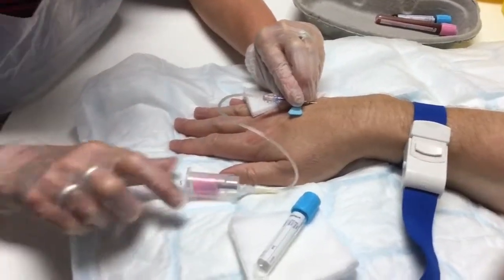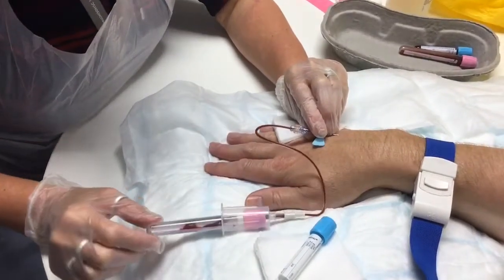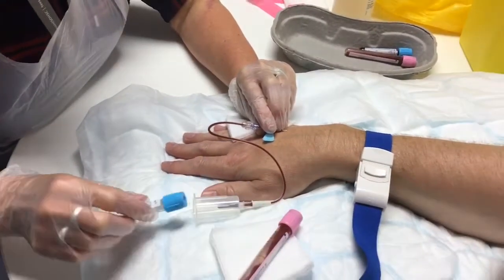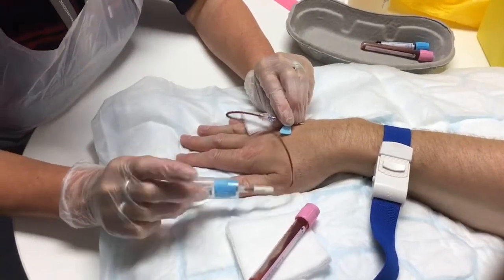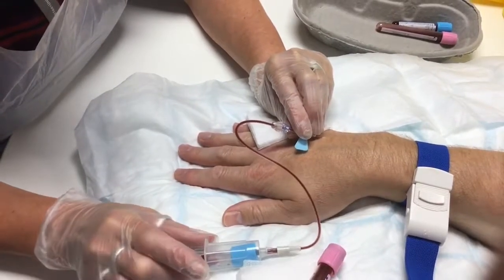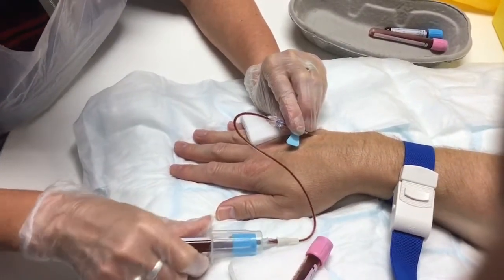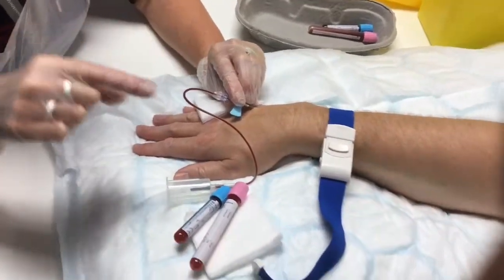Put your blood bottle on and push, and because you've got the vacuum, blood comes down the tube and into the container. I'm not going to take all of Mark's blood. Swap it over, hold the bottle and push it on — lovely, healthy-looking blood coming out. In practice, the containers have to be full to capacity. Hold the bottle, push against it. It doesn't matter so much because you've got the tubing so you're not going to move the needle.